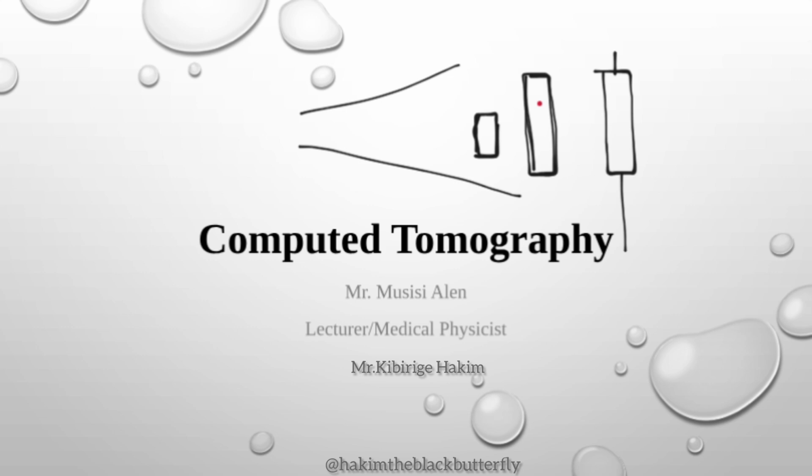In CT, the equipment does not display projected images. It displays slices of images, slices of anatomy. The images are not projected, but are displayed in the form of slices, just like the bread you have at home. You have a whole bread and then you cut it into small slices.